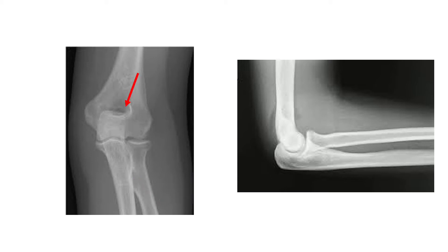This fossa is known as the radial fossa because during flexion of this joint, the head of the radius lies here. This is the capitulum, and the capitulum articulates with the head of the radius.